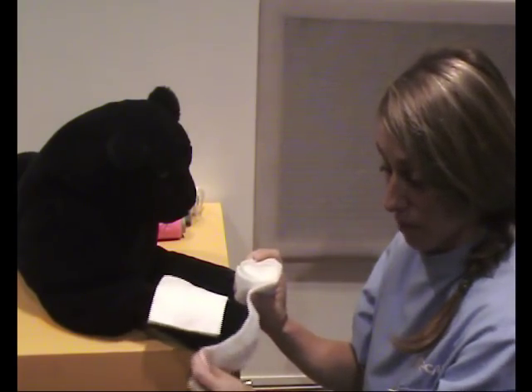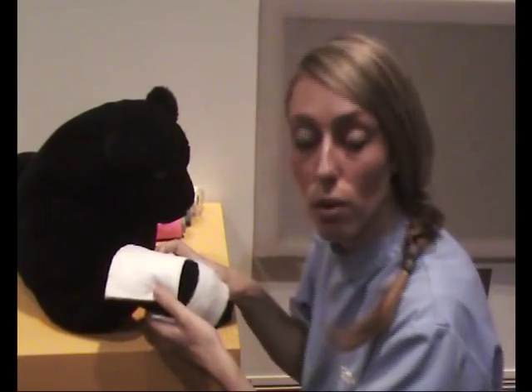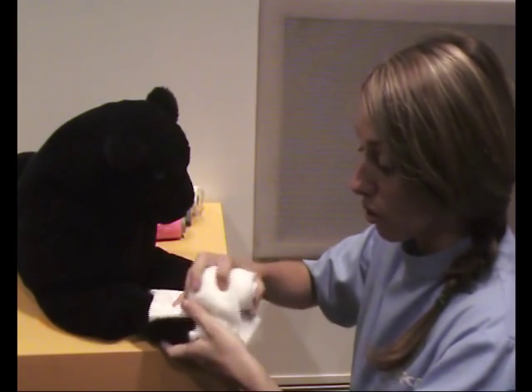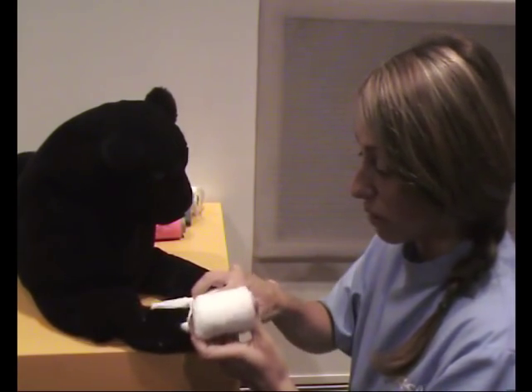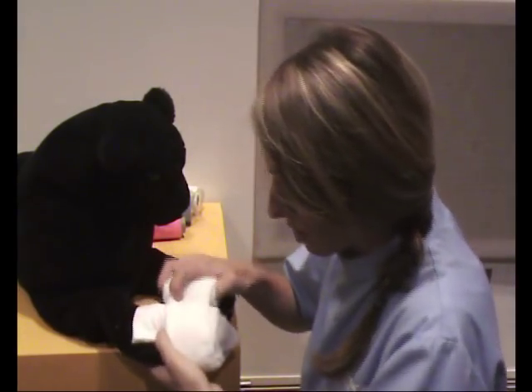We start from the paw end if at all possible. Bandaging the entire paw is good because it will actually stop that paw from swelling up. Conventionally it is best to do the whole paw even if the paw itself is not affected. The paw is the trickiest part.